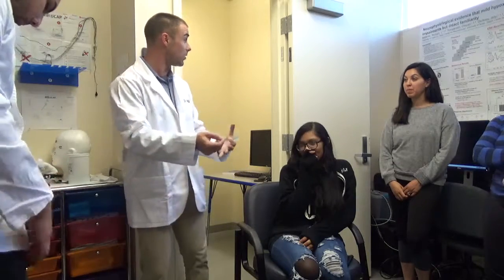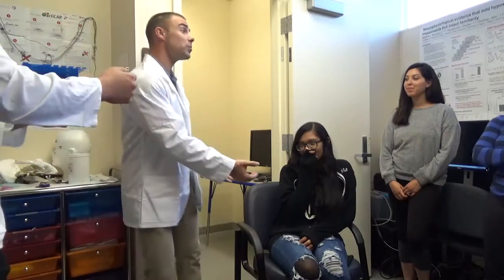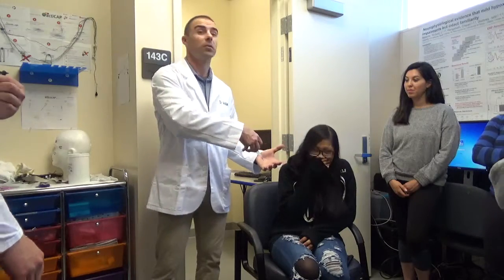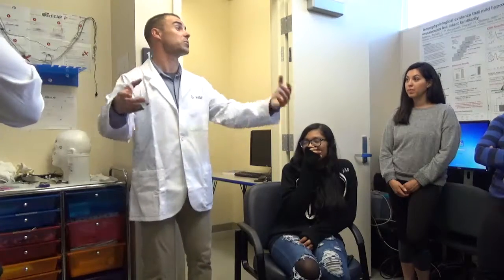Okay, so Jose and I would have come down here and prepared this session ahead of time, so we're not wasting time with a participant whose time is also very valuable. So we would have filled these things up with gel already, or syringes. They would have already seen that. And what you do is you also fill up and cap it off with a little syringe tip. Now, this is a really important part of explaining the consent form to the subject. First of all, you're not doing this while you're consenting them, right? Really important part, because we're doing several goals now. We're talking about this as we're training researchers. We're not actually running the session. So, we would be explaining these things to her.